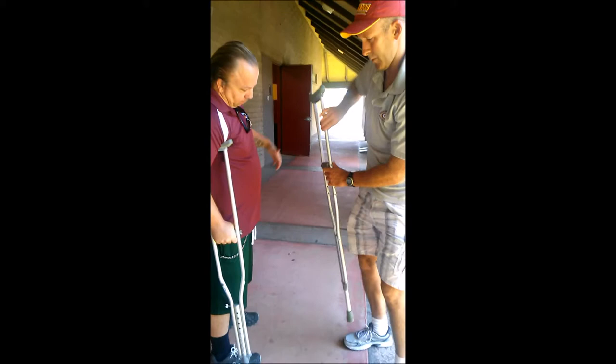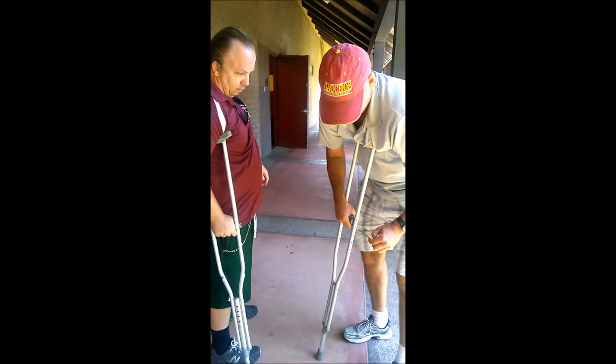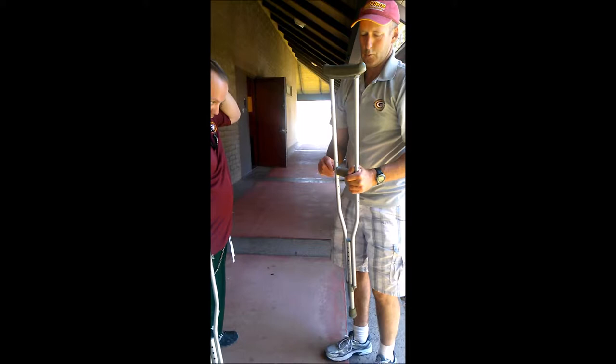People know immediately - not so much with crutches, but with a front wheel walker - if you've adjusted it off. With a front wheel walker you'll be walking on a tripod, and with crutches you'd just be walking around in circles in one direction if you make one side too short.